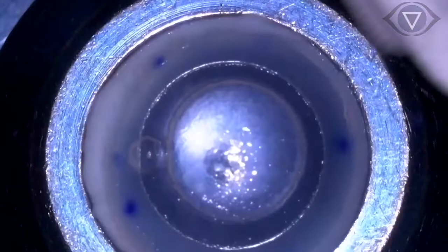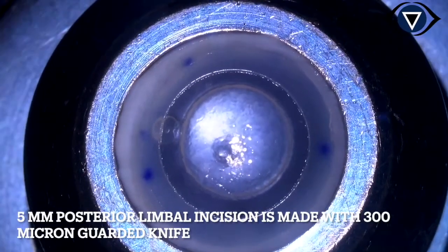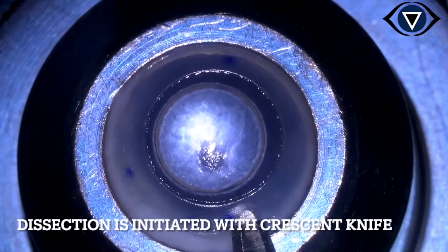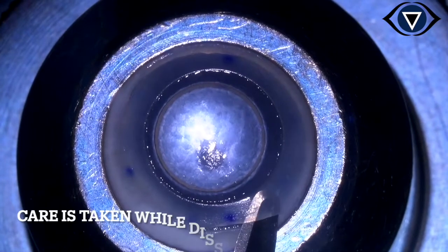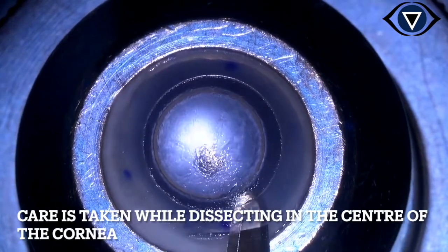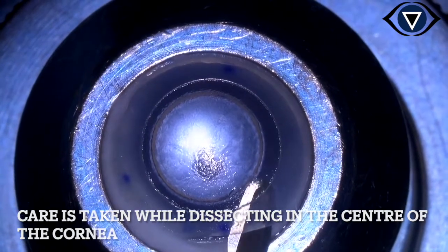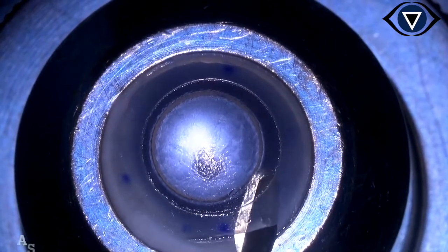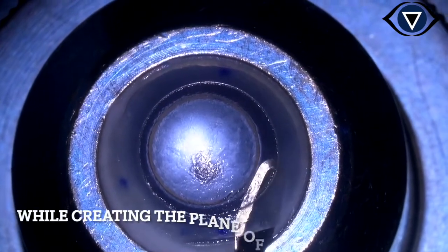But it's not over yet, because after harvesting this inlay, we realized that the donor cornea with a good endothelial cell count is still available with us. So we mounted it on a different artificial anterior chamber. After putting an incision of 5 mm on the posterior limbus, the initial dissection was done with the crescent. Care has to be taken while dissecting this tissue because there is differential thickness in this particular donor cornea, where the center is thin as compared to the periphery, which is comparatively thicker.